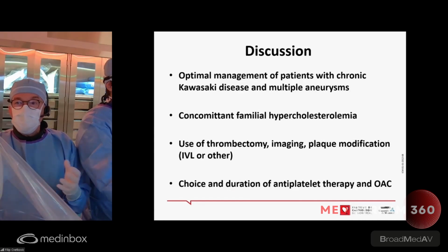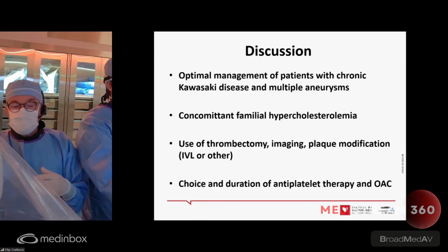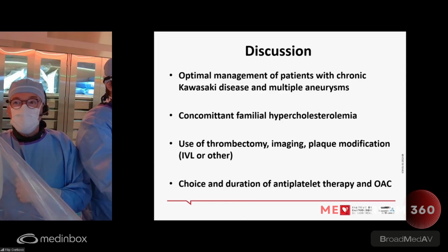We discussed the thrombectomy, routine use versus selective. In this case, I think it was appropriate. It was selective use. Imaging will show you in a few seconds the LAD, the stent, and plaque modification.